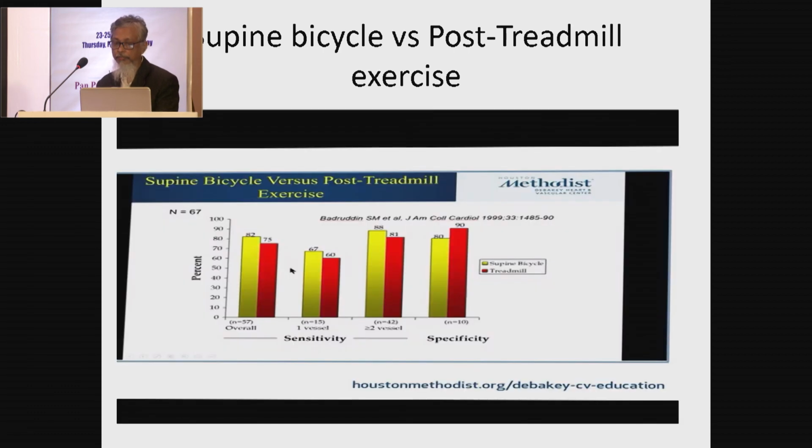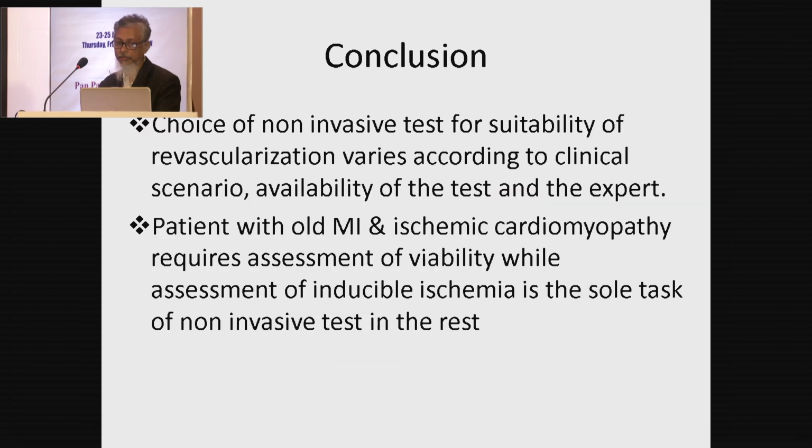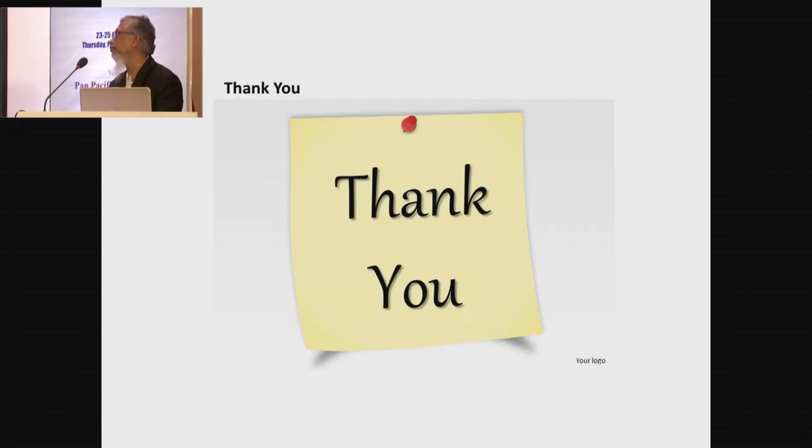So post-treadmill exercise echo is as good as bicycle ergometer, and in a lot of our centers we do have the treadmill and the echo side by side, and we can do this test regularly. So that's all. Thank you very much for the patient hearing.